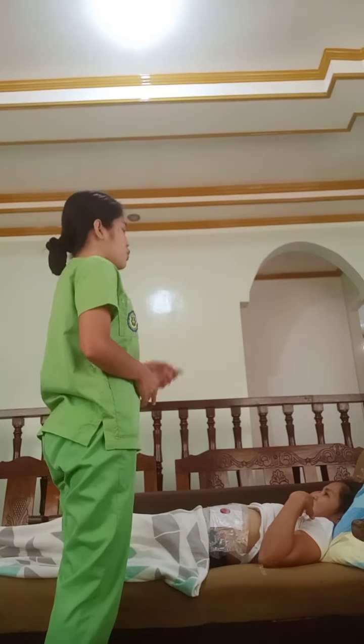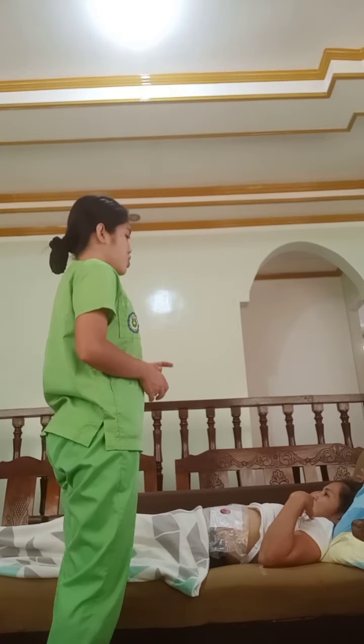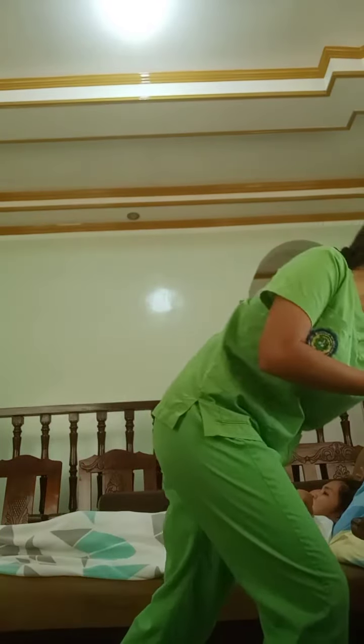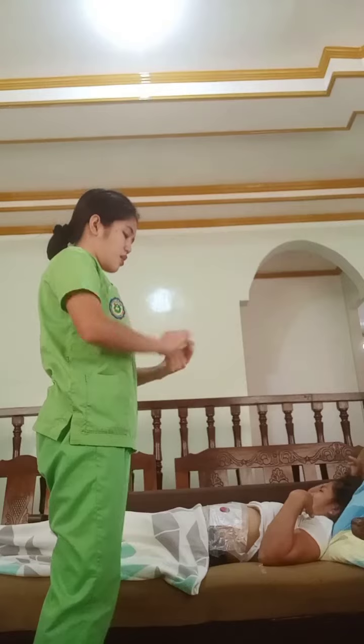The next is we need to provide client privacy by closing the door and closing the curtain. And next is we must wash our hands by performing hand hygiene. And then next is to put on gloves.